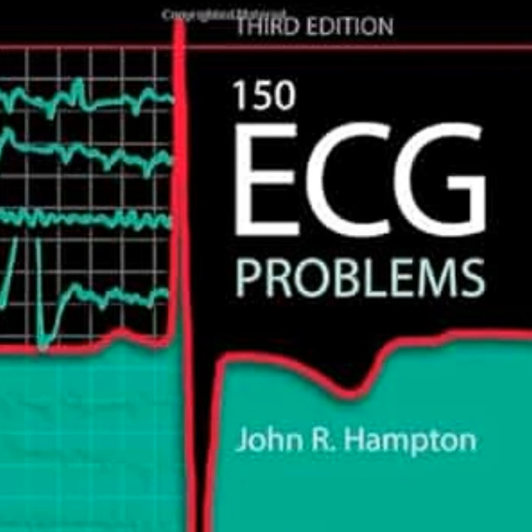That makes so much sense, but I feel like that puts the clinician in a really tough spot. Especially when you're dealing with athletes. Oh, absolutely. Sports cardiology is tricky. Right, because we know that athletes undergo physiological remodeling, athlete's heart. But we also know that asymptomatic hypertrophic cardiomyopathy, HCM, is a leading cause of sudden cardiac death in that exact same demographic. It's a huge concern. So if a young athlete's ECG is showing this massive voltage and maybe even some weird repolarization abnormalities, how do you clinically differentiate between, oh, they just have a thin chest wall or a physiological adaptation versus a lethal septal hypertrophy? That's the critical question.